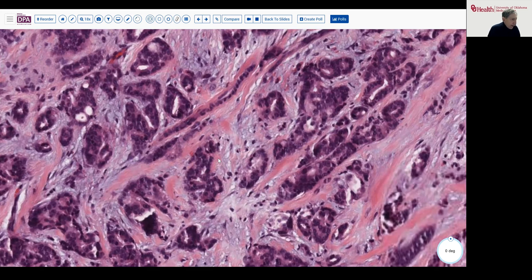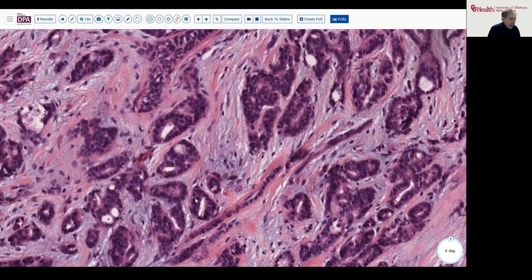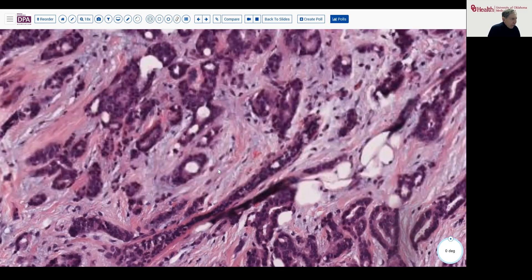And there's not much in the way of mitotic activity. Sometimes you can get that information from looking at the report, but not always.